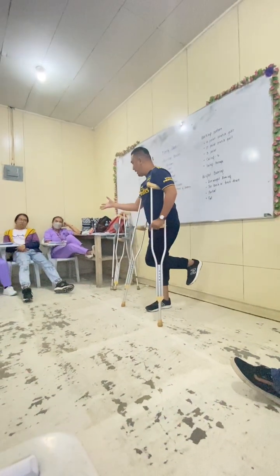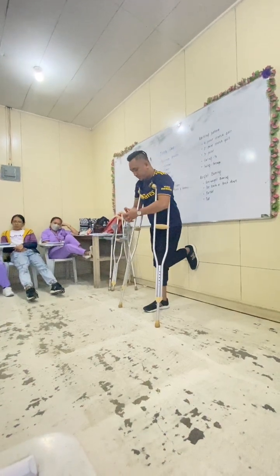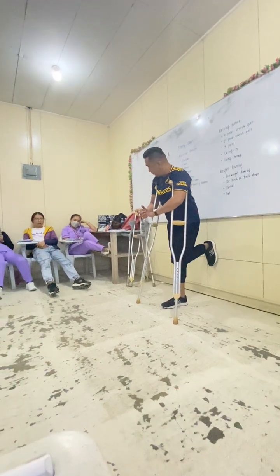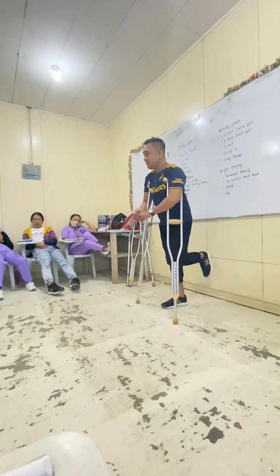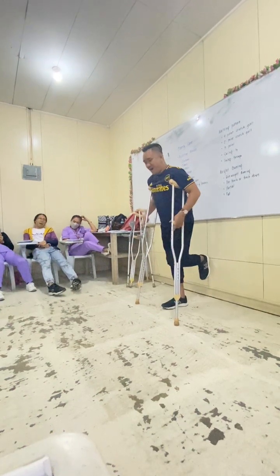Okay, so can you read the walking pattern for 3-point? Move both crutches and the weaker affected lower limb forward. Okay. Bear all your weight down through the crutches. Okay. Move stronger or unaffected limb forward. Complete the walking pattern. Okay, very good.